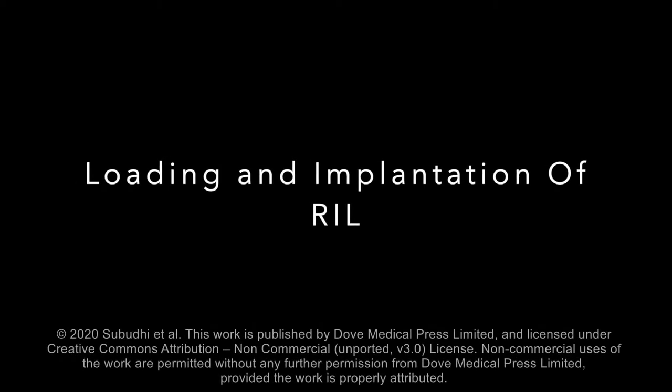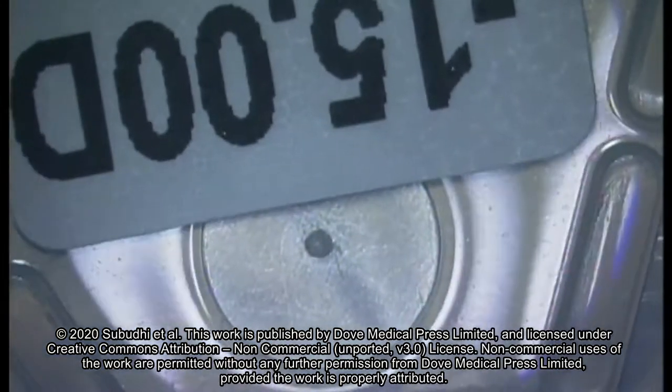Implantation of RIOL. First, RIOL with appropriate power is removed from the pack.